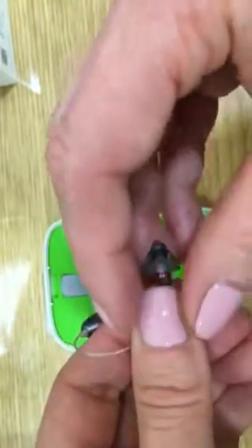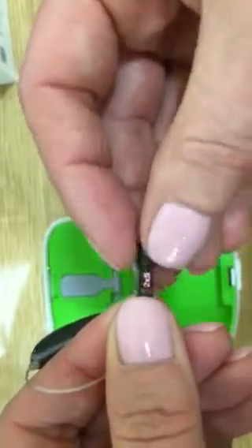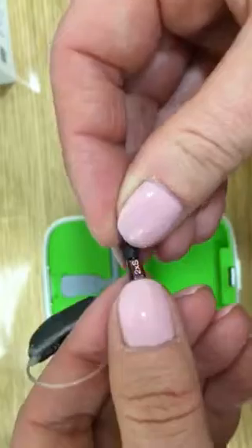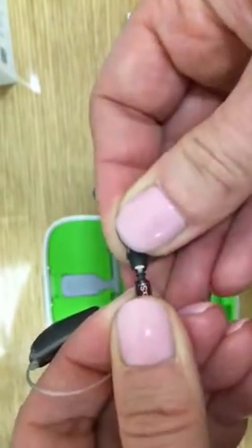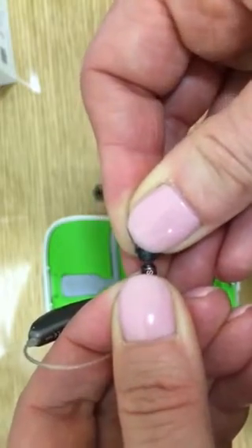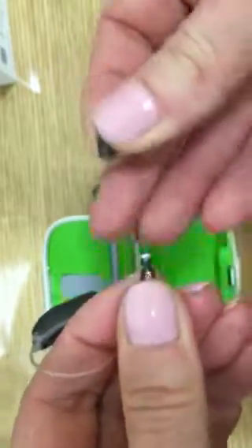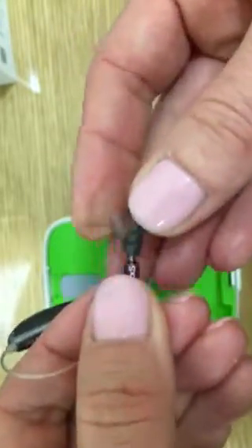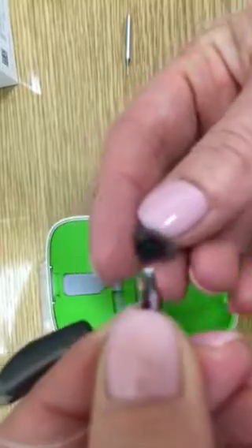When placing the dome back on, always check that it's been correctly attached. There's a small rubber sleeve under the dome, and this rubber sleeve has to completely cover the extension of the receiver, and the dome will now be securely attached. If this has not been attached correctly, the dome may not be secure and may certainly come off in the ear.